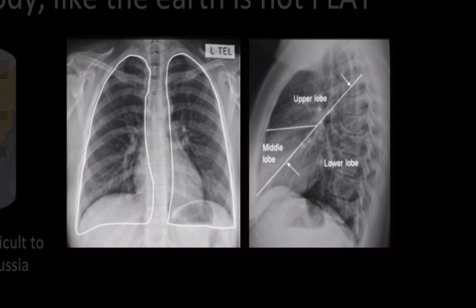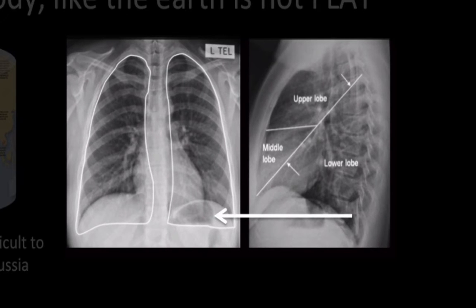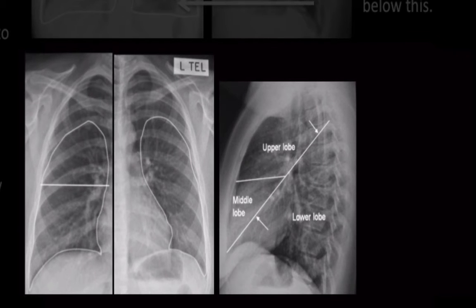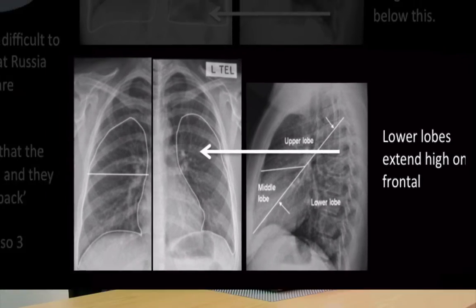If you look at a frontal chest radiograph and a lateral chest radiograph, you can see that the diaphragms visible on the frontal radiograph do not indicate the lowermost extent of the lung. On the lateral, the lower lobe extends far beyond the anterior domes of the diaphragm. So when looking at a frontal chest radiograph, note that there may be lung disease below that level. Similarly, the lower lobe extends far higher than you might think — on a frontal radiograph it may project into the upper zones. The arrow shows the apical segment of the left lower lobe projecting quite high up. I prefer to refer to zones on the chest rather than lobes, as it communicates what you want to say without committing to a lobar distribution, and it makes no difference to treatment.